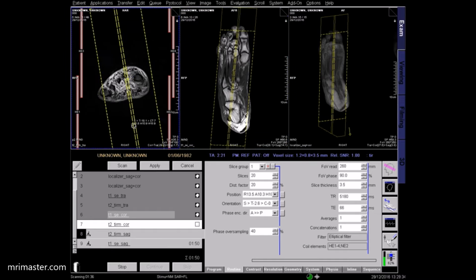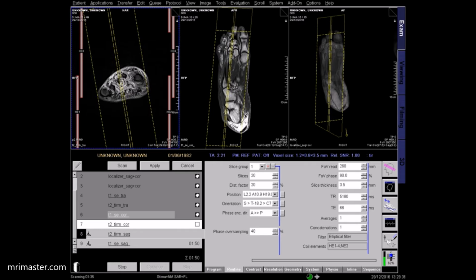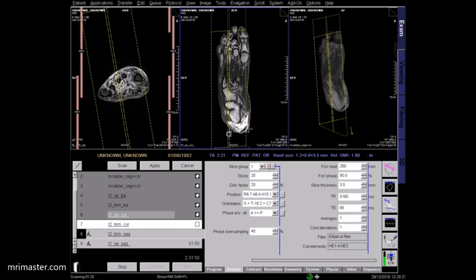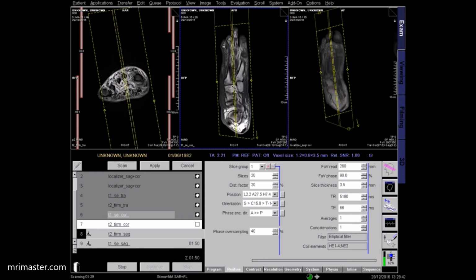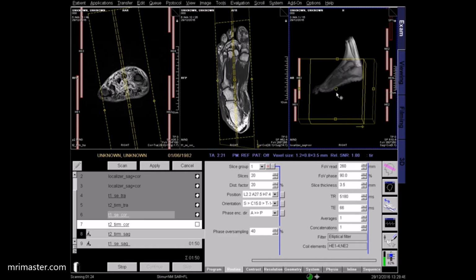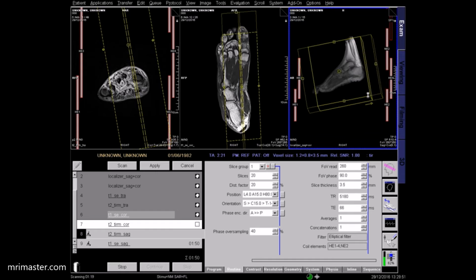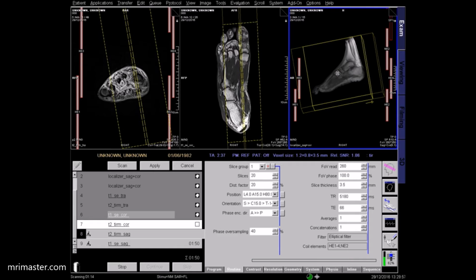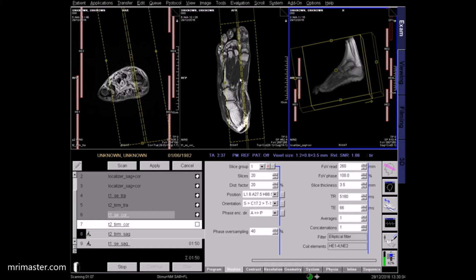On the axial sequence, angle the block perpendicular to an imaginary line drawn across the metatarsal bones, or perpendicular to the coronal planning. On the coronal view, plan parallel to the long axis of the metatarsals to cover the full length of the foot. Ensure coverage from side to side. Center the foot on the sagittal localizer, adjusting the field of view or the FOV phase as needed. Check alignment and centering, adjust again, and apply.